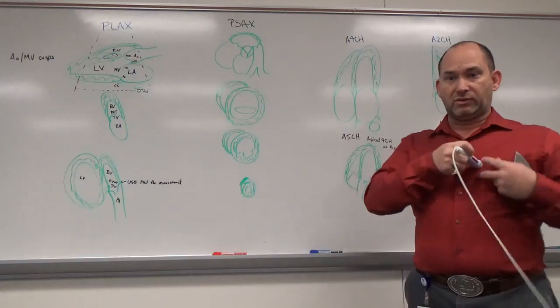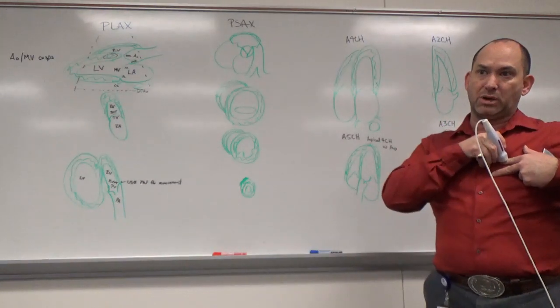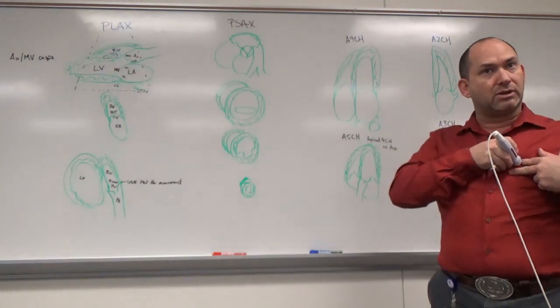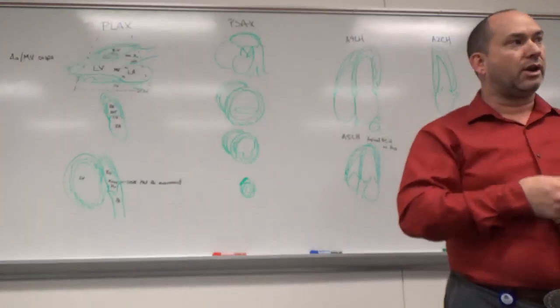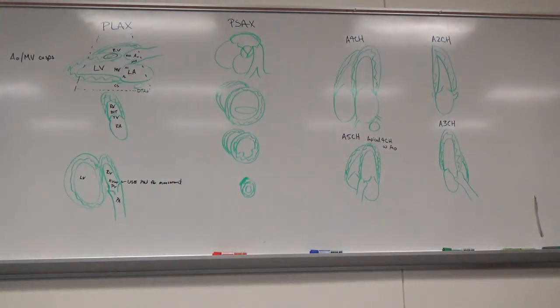Okay, either rib spaces or even those very slight motions might be just enough to get the beam between it, and you might be okay in that rib space, but you've got to move mildly in there. If that doesn't work, jump a rib space, okay, and then try again. And then what else can we use on the patient to help that window?